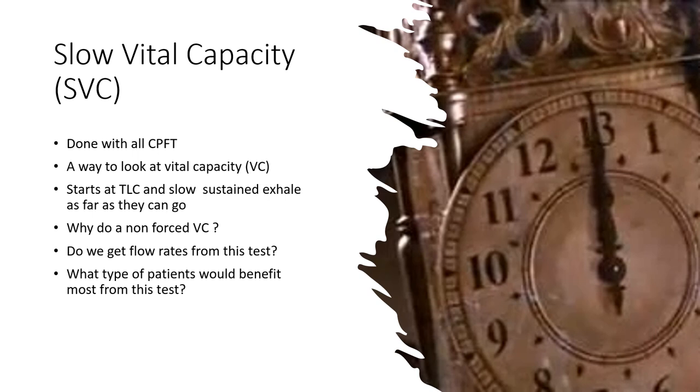The first test that we'll talk about is the slow vital capacity. This is done with all complete pulmonary function tests. And this is a great way to look at vital capacity.